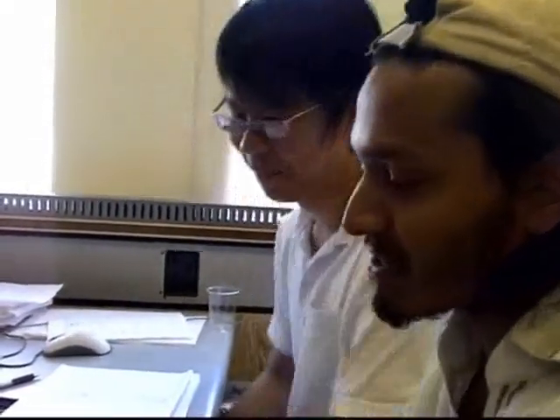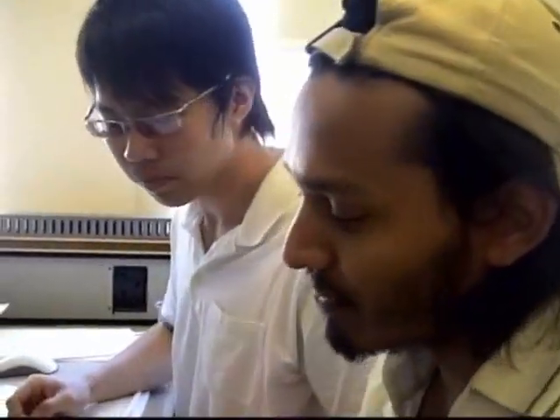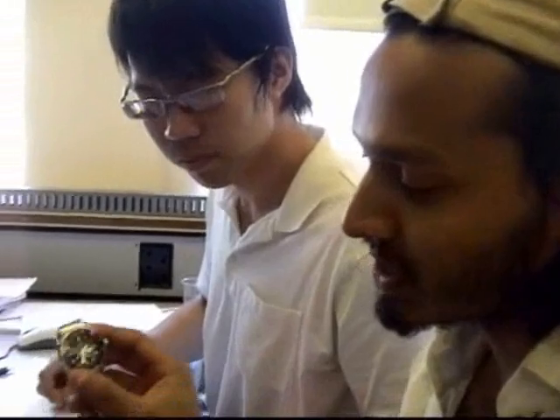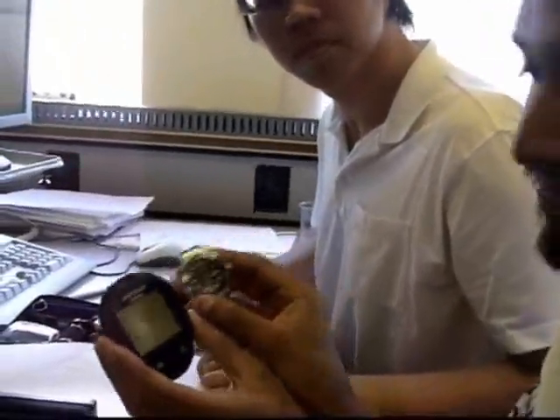We're going to do the blood sugar level test today. We'll use this sensor to measure what the blood glucose level is at minimum per hour, and we're going to show you what time we're doing the testing.